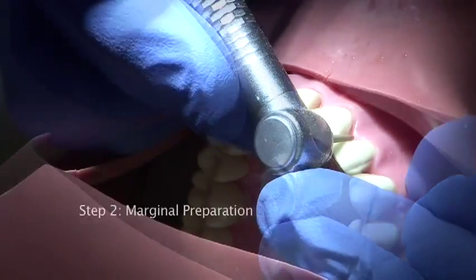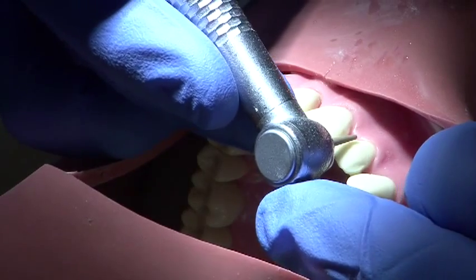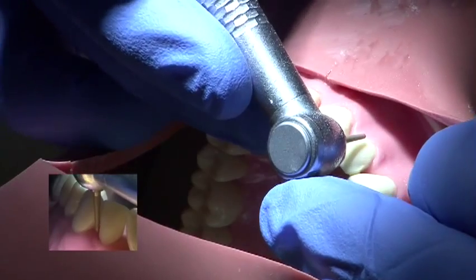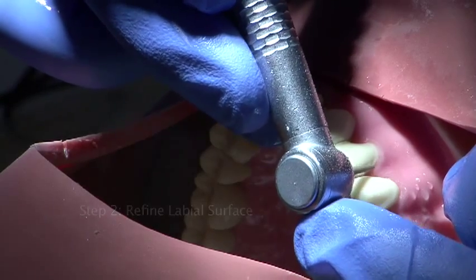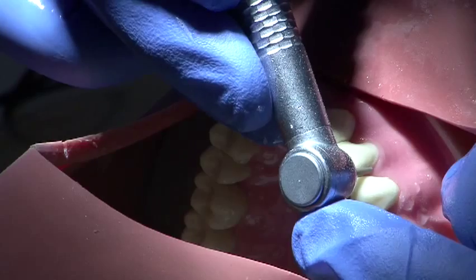A chamfer margin of 0.5 to 0.7 mm is used. The natural gingival outline must be followed to ensure that the margin is not visible. The preparation is carried interproximately without breaking through the contact. This ensures that the margin of the veneer is not visible when it's cemented.